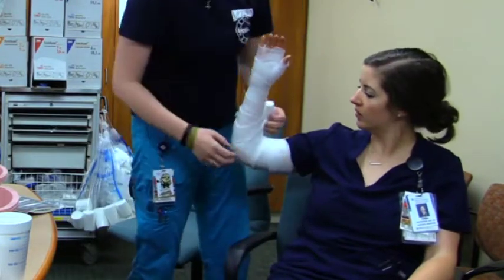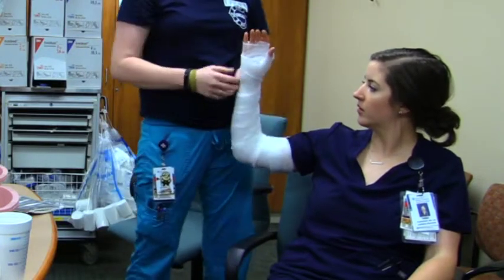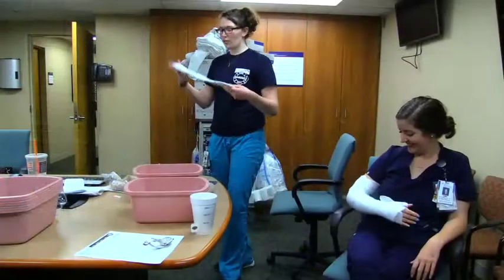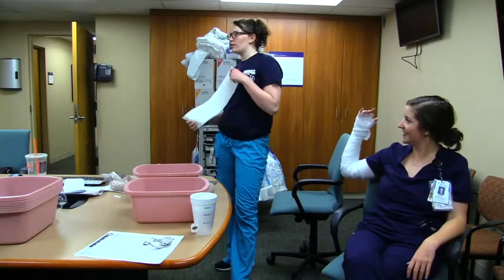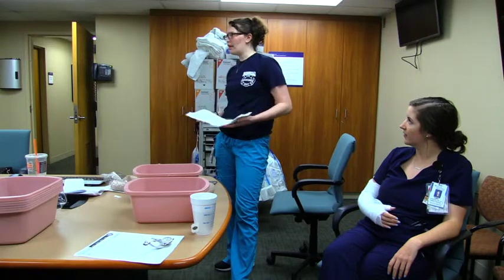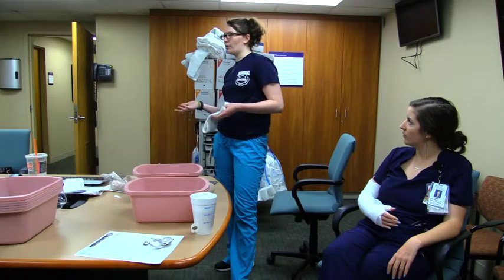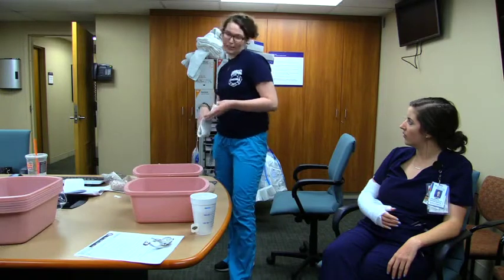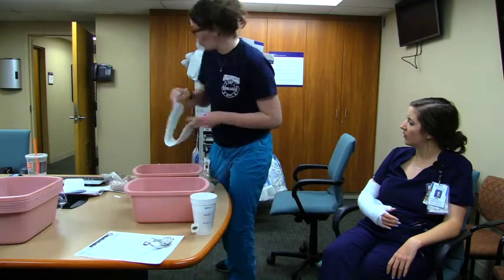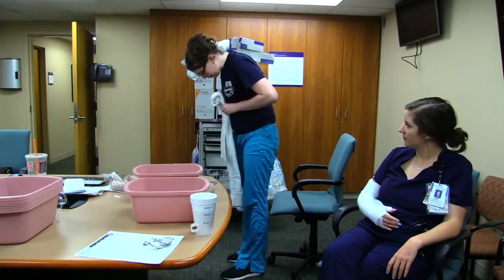Then back around. I usually go there and back so that it's double layered. Usually in the rooms we've got a sink, and I usually just run it under the sink because you don't want it completely sopping wet — you'll be there all day waiting for it to harden as you mold it. But since we don't have a sink in here, I'm just going to dunk it in the water and bring it out.